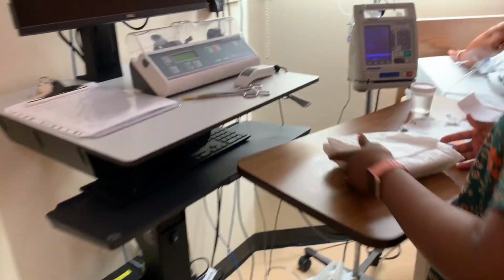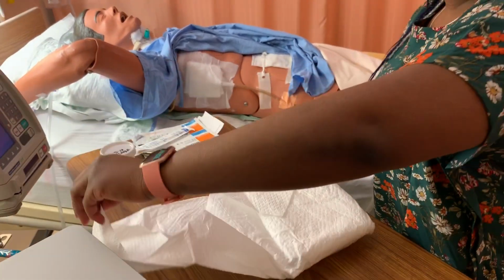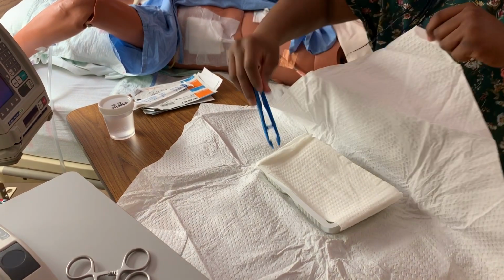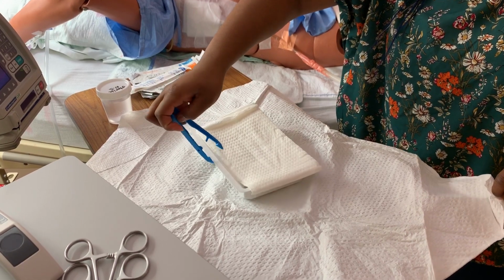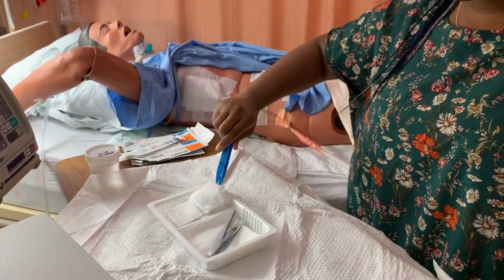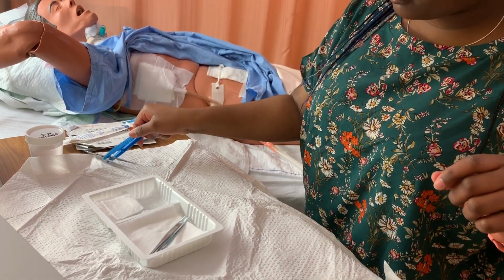So now I'm going to open up my sterile field. I'm not going to use this, I'm going to get rid of it. And I'm not going to use this, this is just my bin. I'm going to be using sterile non-touch. So I'm just going to get all my supplies ready.